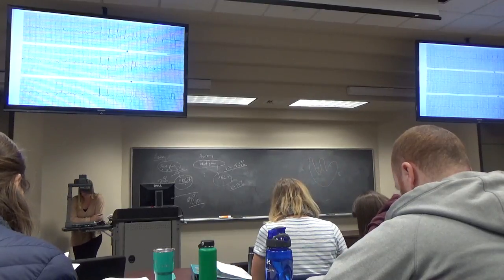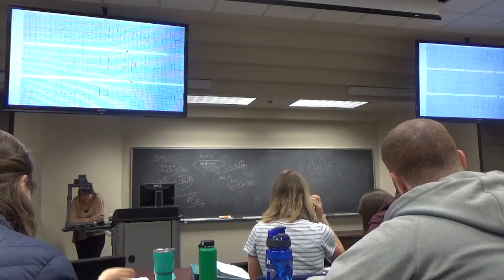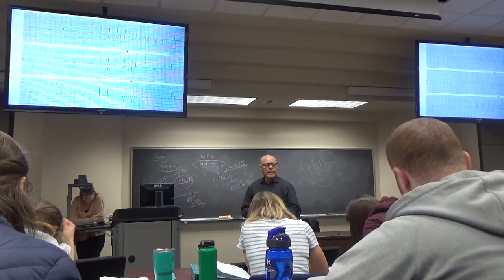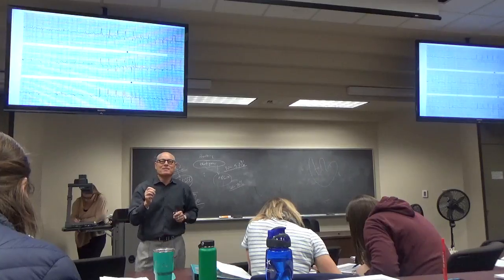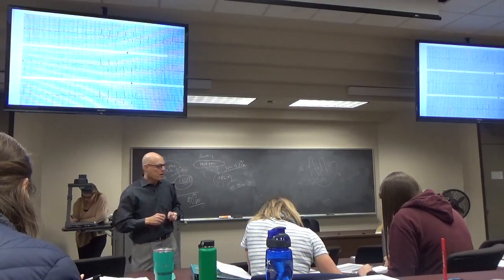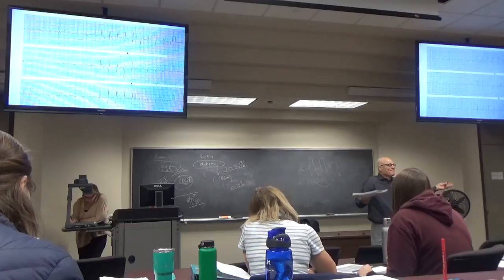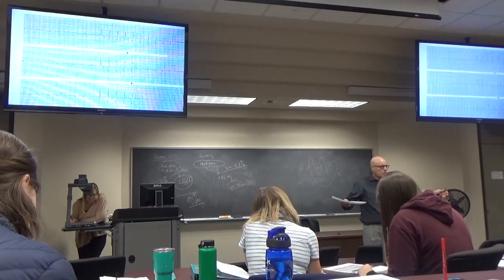This is when my caliper really works well. When I check the QRS in V2, let's see. It's a little tiny bit bigger than three boxes. It's really 0.13. Why do I look that hard? Because when I glance at this EKG, it looks like a bundle branch block. No bunny ears, that's true.